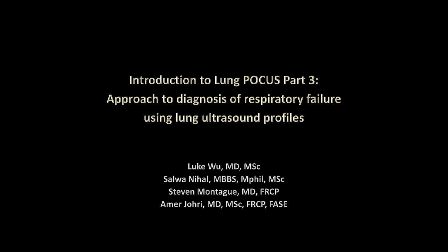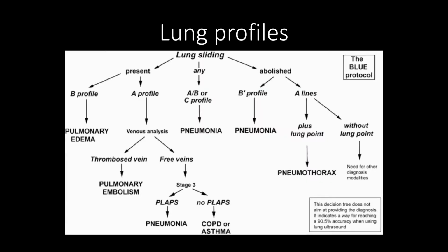Welcome to part 3 on this introduction to lung ultrasound. In this section, we'll be focusing on an approach to the diagnosis of acute respiratory failure using lung ultrasound profiles. The concept of lung ultrasound profiles was initially developed by Lichtenstein et al.